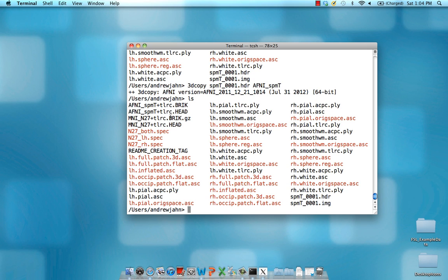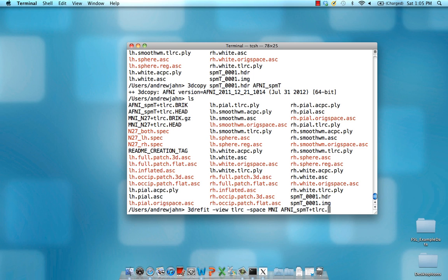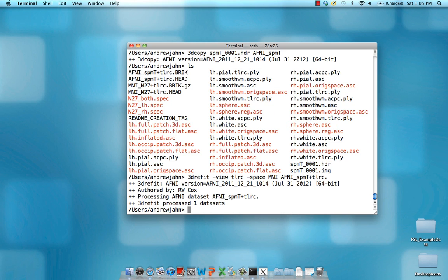You can see that generated AFNI_SPMT, both the brick and head. In order to project it into standardized space, we need to type in the command 3Drefit. It is going to be in the view TLRC for Talairach, and space MNI, and then the name of the file itself, which is AFNI_SPMT+TLRC.